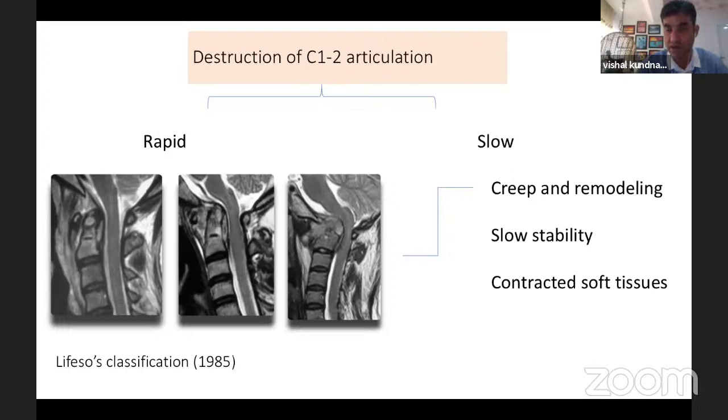Cervical pedicle screws are extremely handy, and in some cases they are the anchor fixation points of choice. However, for other cases, meticulous planning and bicortical anchor purchase with lateral mass screws will often suffice, particularly in simpler cases where deformity is not a major concern and where mechanical forces are in your favor.